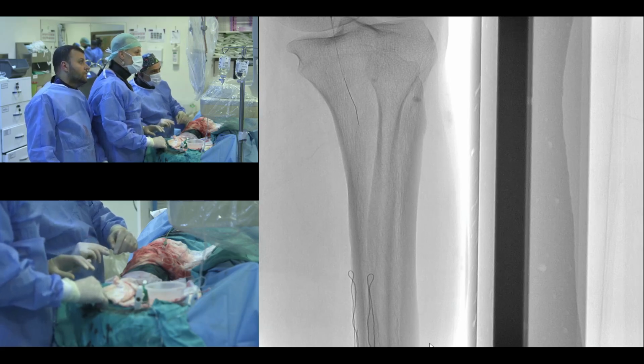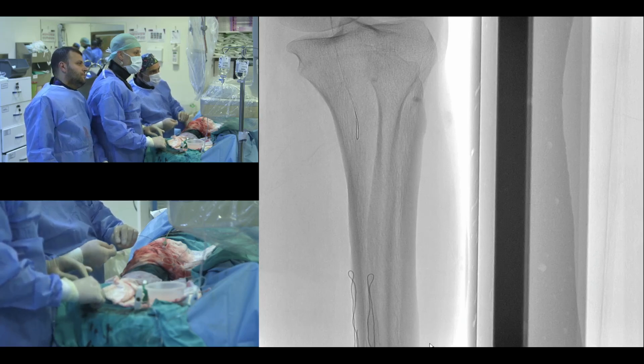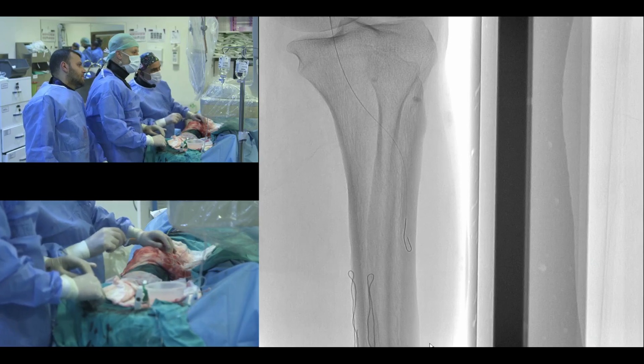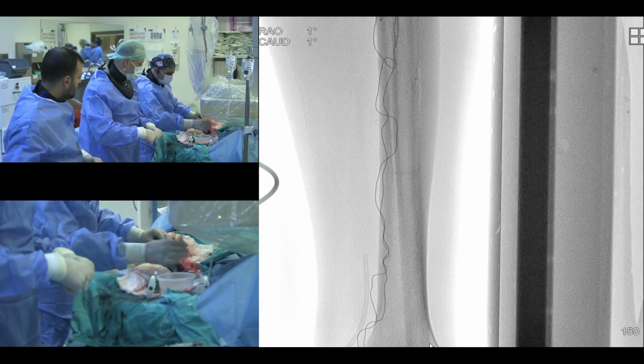Now, I am not sure whether the vessel we are crossing now is a collateral or the tibialis posterior artery.